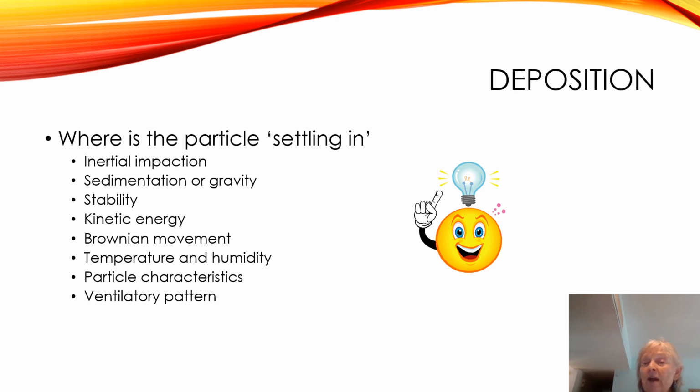And sometimes we have a problem when we teach our patients. Patience is always important when working with patients. We talk about doing a breath hold. We do the breath hold because we're waiting for the particles to run into each other, become a larger particle, and rain out. If we don't do that breath hold, especially with our small volume nebulizers, and we don't do it all the time, but with our MDIs, we're going to have a problem because we're not going to get the medication to do what we needed to do at that particular point.